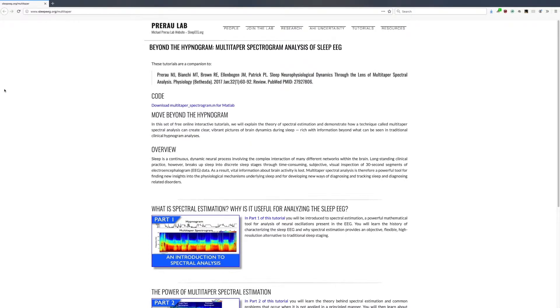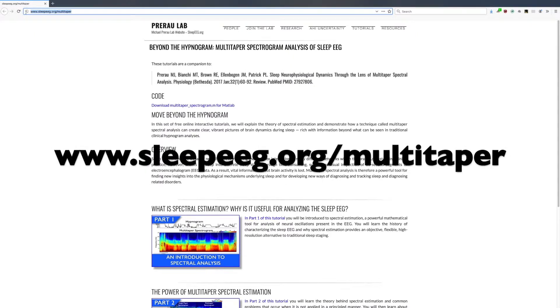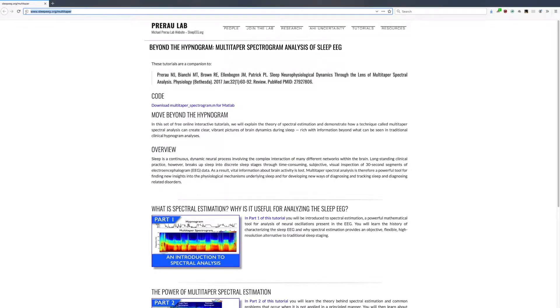In this video we're going to talk about what it takes to actually implement the multi-taper spectrogram, and you'll find that it's actually quite straightforward and simple. Just a reminder that everything you need can be found at sleepEEG.org/multi-taper. This includes the code that we'll talk about today as well as the other step-by-step modules that teach you about why the multi-taper works and how we can use it to look at sleep data in a more efficient manner.